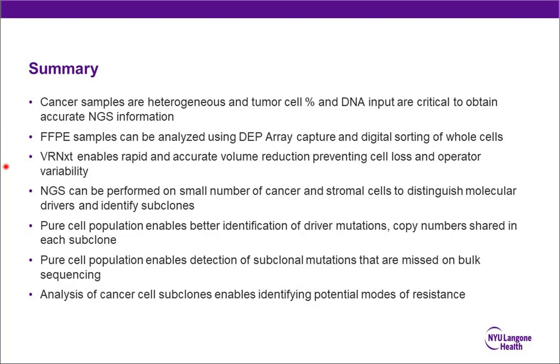It is part of a protocol. It's regular deparaffinization with xylene, so you need to have a xylene hood, but that's all you need to do. It's pretty simple. If you know how to deparaffinize whole slides for any other method, it's the same. The one caveat, obvious for anybody who does next-generation sequencing: decalcified samples will not work with this technology, not because it's a problem of DEPArray, but because decalcified samples just don't work with next-generation sequencing well.